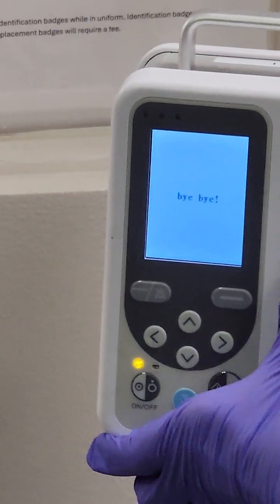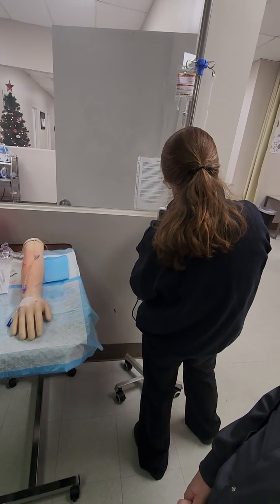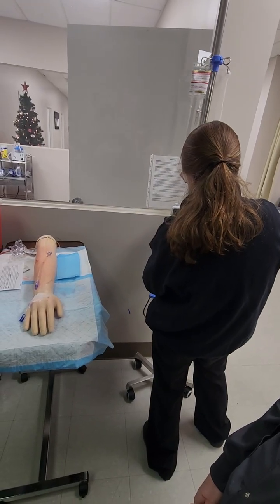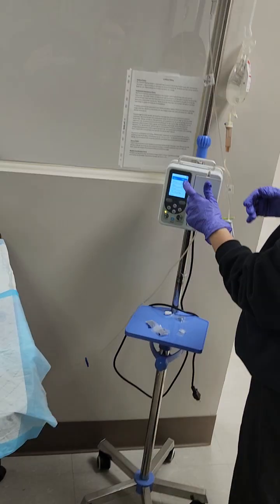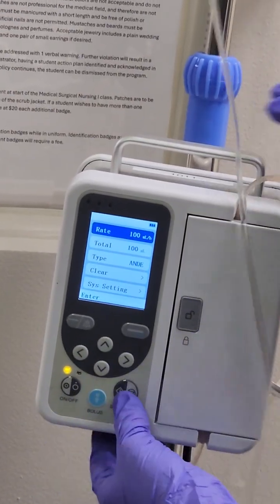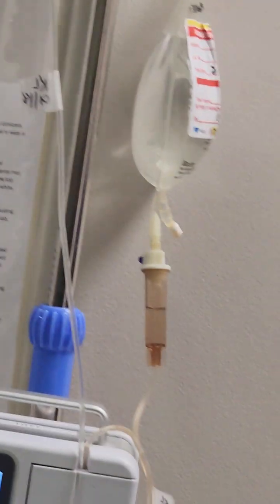I want y'all to actually see it infuse. Hang on, it's got some air in it. So I have it set for 100 an hour. Total volume to infuse is what's in my bag, 100. Got everything unclamped, start. Then I'm going to watch and make sure that it starts infusing.